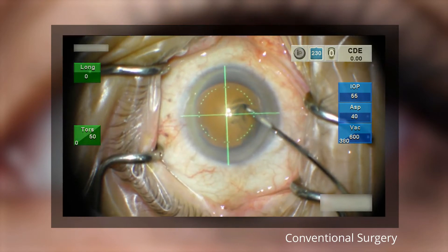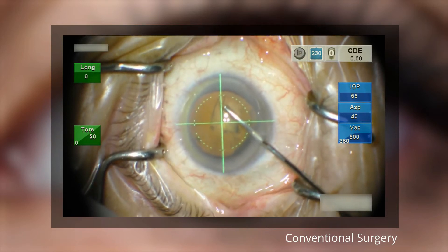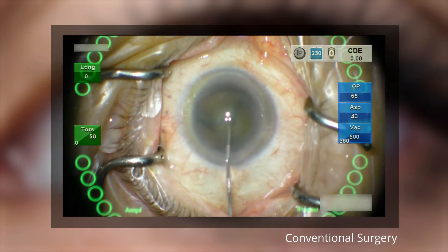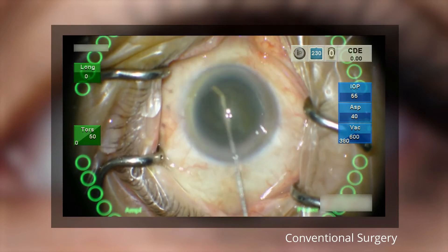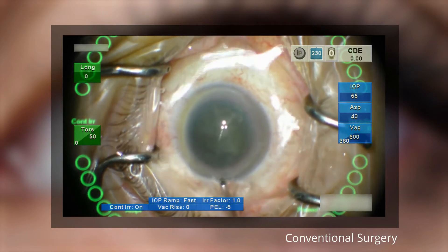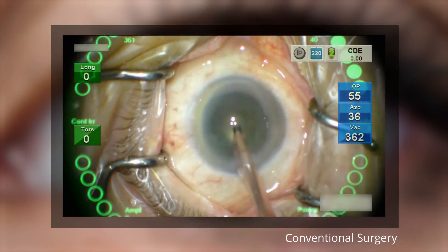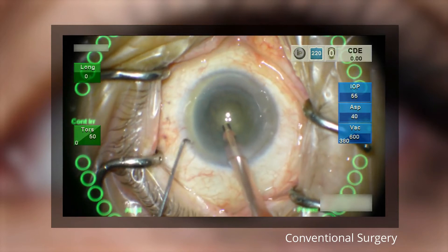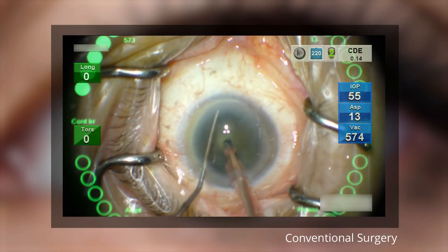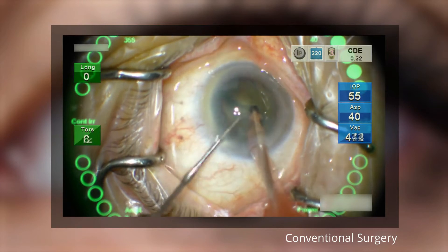This is followed by manual capsulorhexis. The surgeon performs a full hydrodissection and ensures that the lens is separated from the capsule by rotating the lens. The manual stop-and-chop technique is used for lens fragmentation. For phacoemulsification, a balanced tip is used to allow efficient amplification of ultrasound energy at the distal end, contributing to low CDE, as seen in the top right.